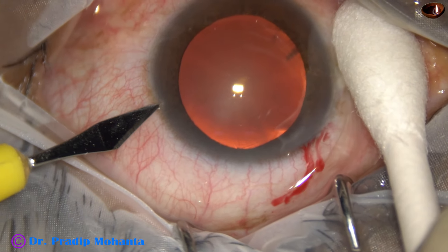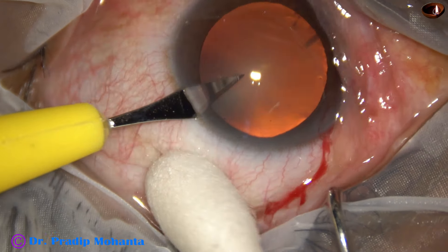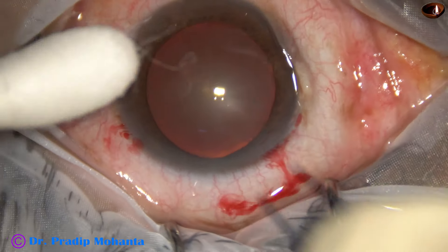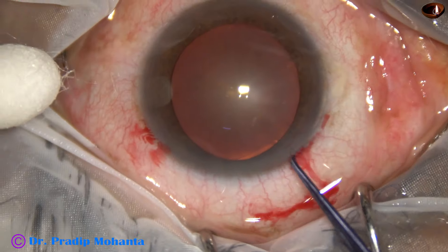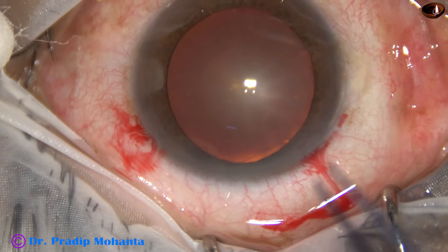A side port is done on the left side of the main incision, about 90 degrees away from the main incision. And now capsulorhexis is done with the help of a utrata forceps.